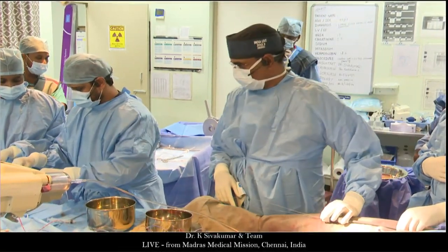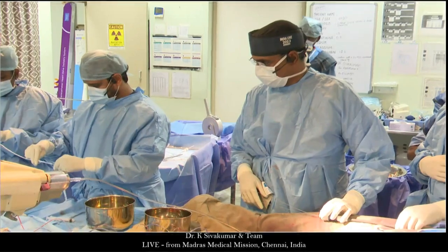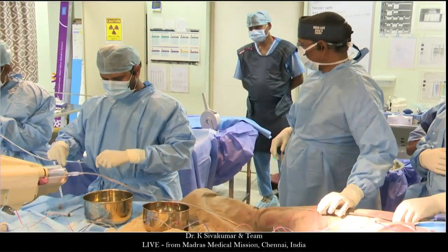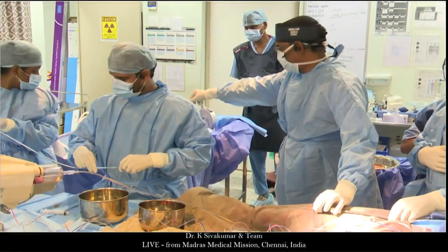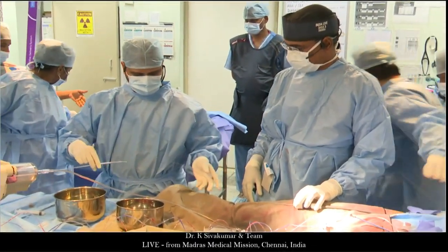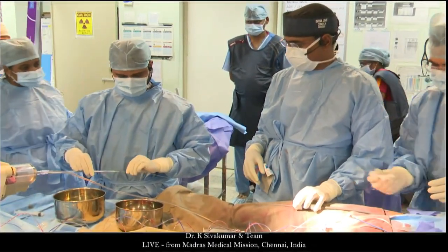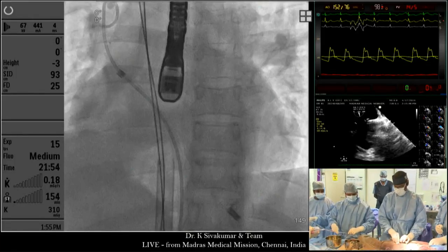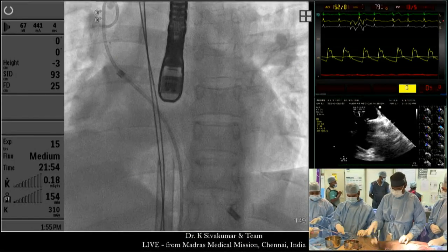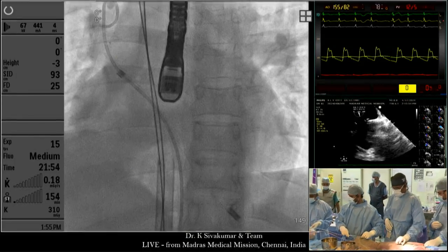That's fine. While you're doing this, I'm going to ask the audience by show of hands: in your center, do you do transcatheter repair of sinus venosus ASDs or surgery? Transcatheter, raise your hand, please. Okay, surgery. Obviously, the majority in the world still use surgical repair of sinus venosus ASDs.